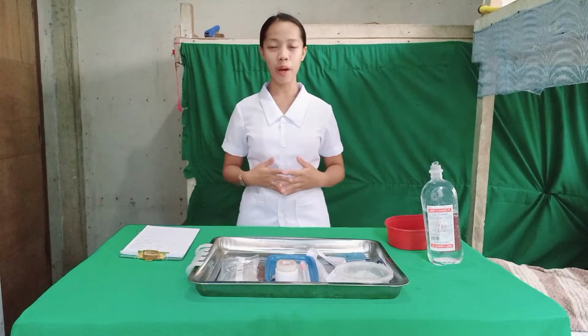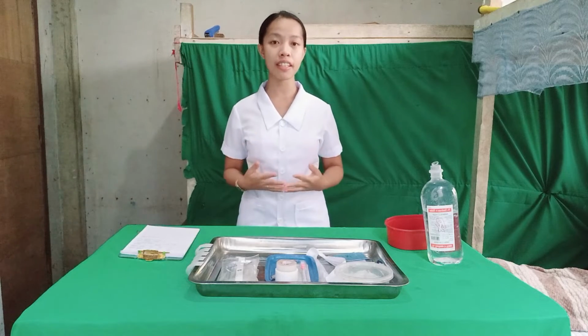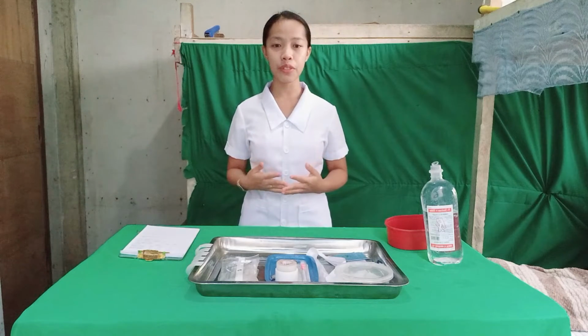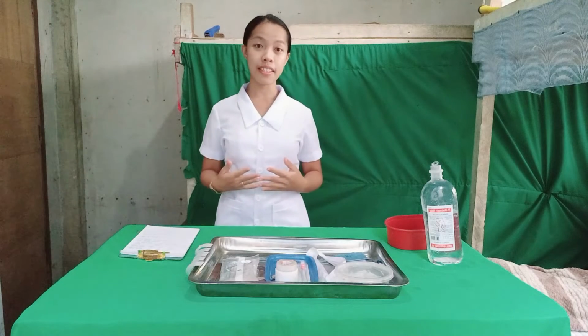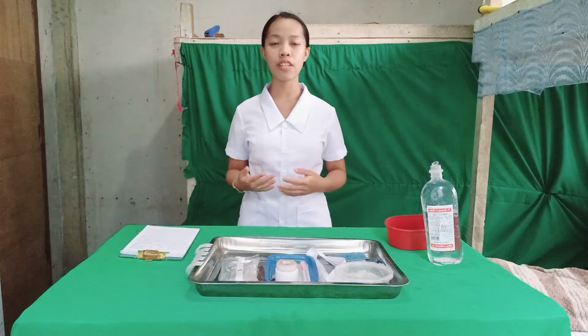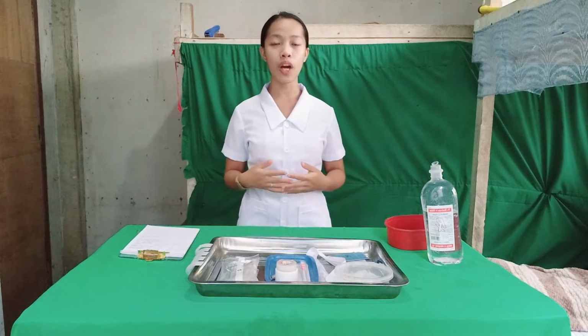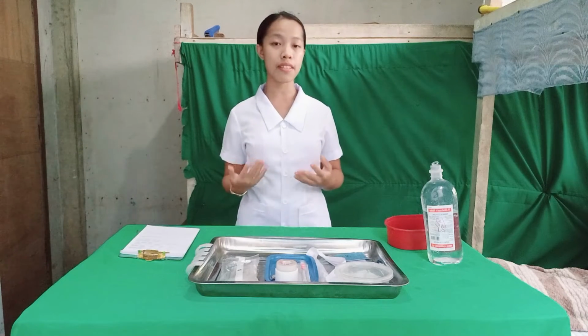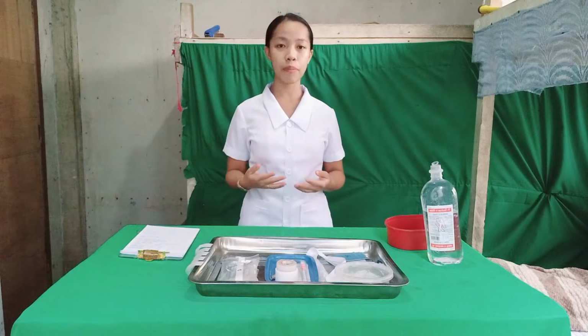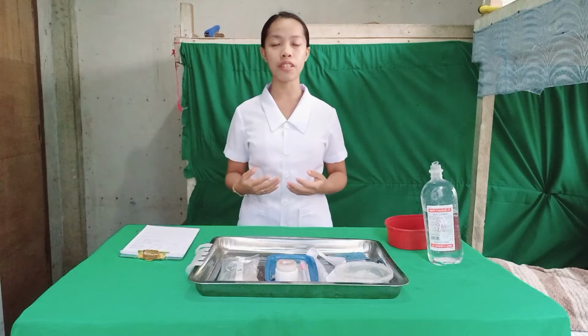I am Anilin Buhawi, and today I will be performing a return demonstration of starting and discontinuing intravenous infusion. Intravenous therapy is the aseptic installation of fluids, electrolytes, nutrients, and medications through a needle into a vein. The purpose of this procedure is to administer fluids and chemical substances when circumstances prevent the patient from consuming a normal diet and oral liquids.